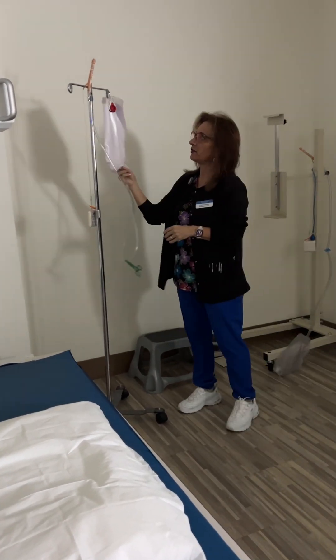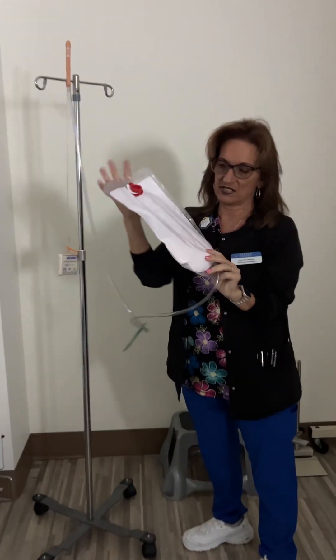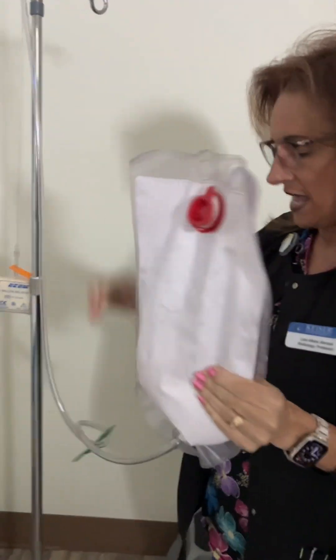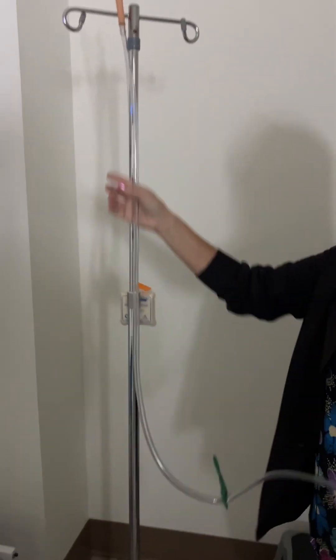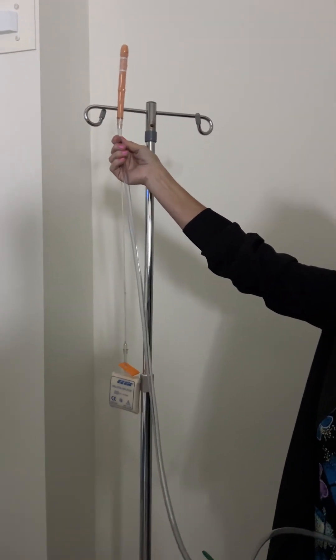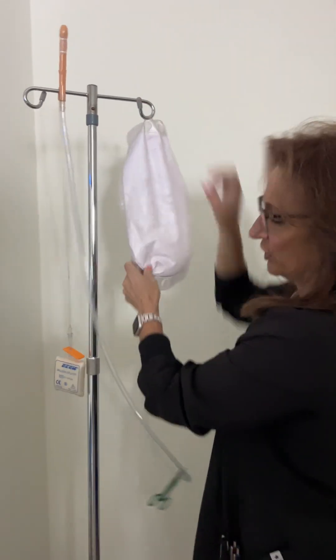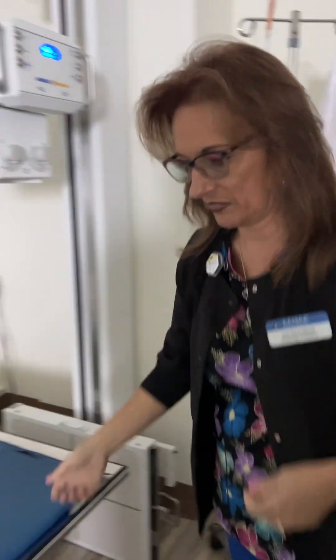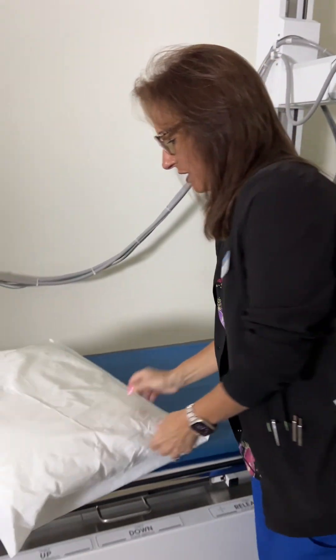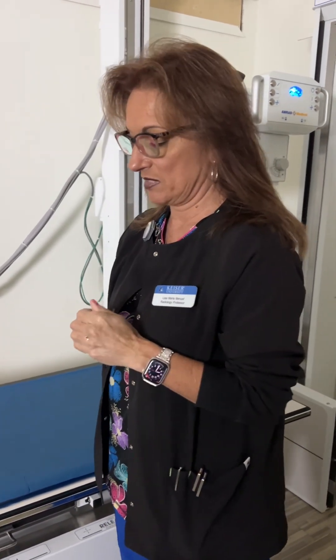For the single contrast BE, I would have 2,500 cc's of barium mixed in the bag with water added. The barium would be run down almost to the tip so I wasn't introducing a bunch of air. I'd have that ready to go. My patient would already be on the table in Sims position — lying on her left side with her right knee bent forward.